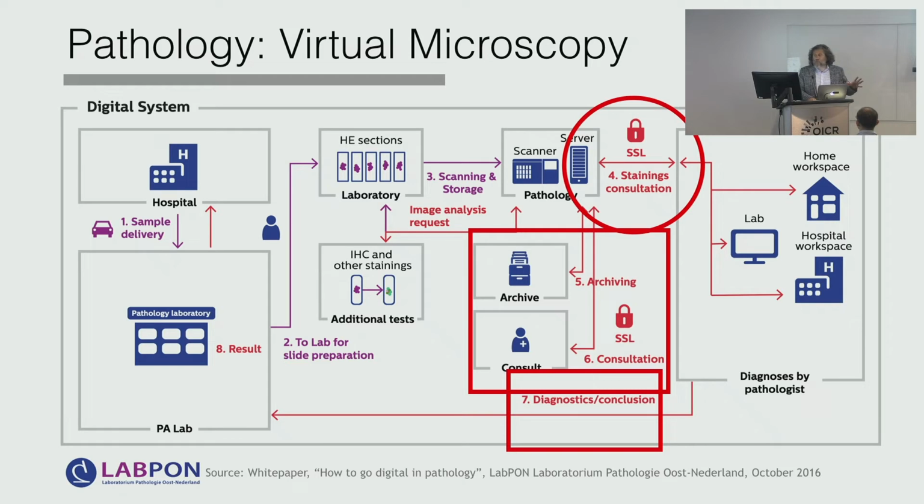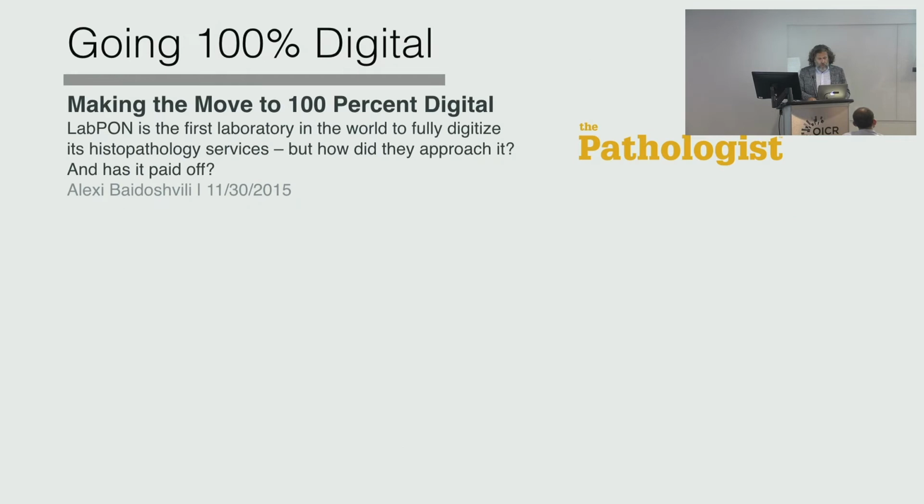So storage-wise, you need high-end, high-performance storage. You cannot just put it on HDD. You need SSD type of storage. So this type of thing could be regarded at the same time as a challenge or a benefit of going digital.